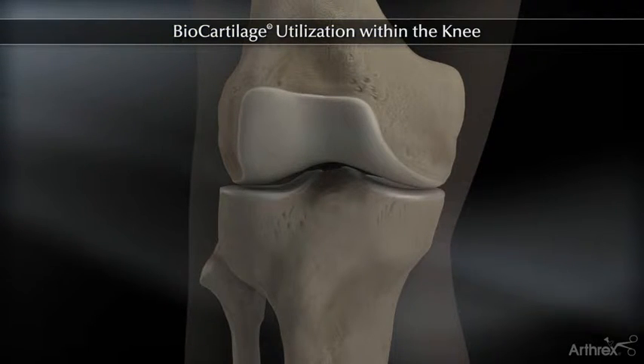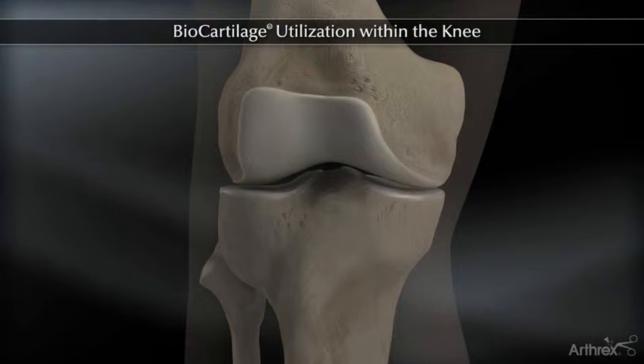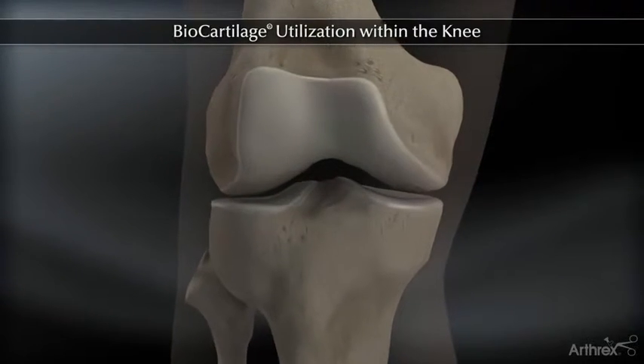Biocartilage is an extracellular matrix derived from allograft cartilage, meant to serve as a scaffold over microfracture defects.